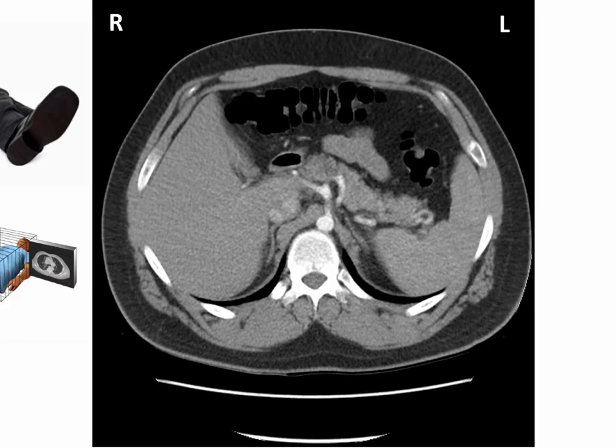We will read this CT starting from inferior and moving superiorly. The inferior limit of our thoracic cavity is the inferior thoracic aperture. Posteriorly, this is at the level of the T12 vertebrae, here. It is articulating with the head of the 12th rib, here, at the costo-vertebral joint.